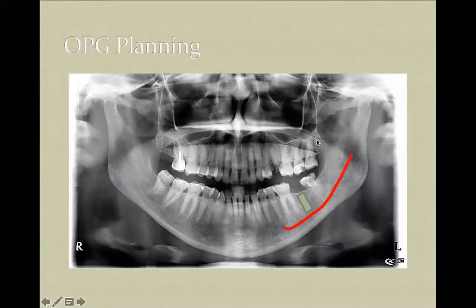You place the dental implants, and you place bone grafts here. This procedure, according to our educational program, will be discussed in the first year of your education. This is a kind of advanced dental implantology, and it's a little bit difficult to understand all the tricks of this procedure without being educated, but you will be educated in the third year.